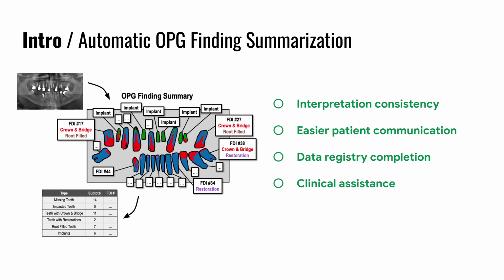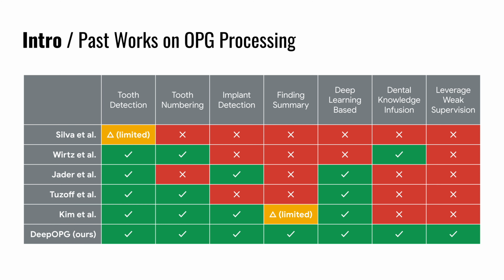In the clinical workflow, it also assists dentists with the treatment decision process, and the summaries can be logged into a data registry for subsequent data analysis. One big challenge for existing works is that they don't cover features that are highly requested among dentists.